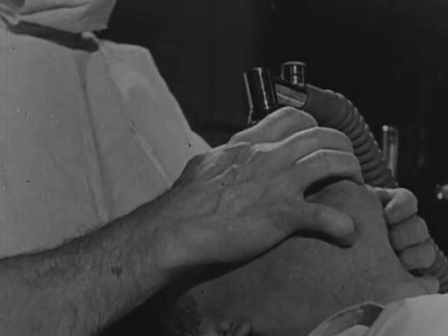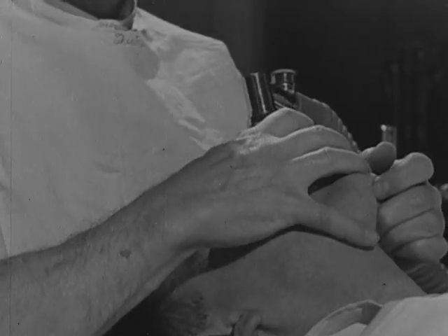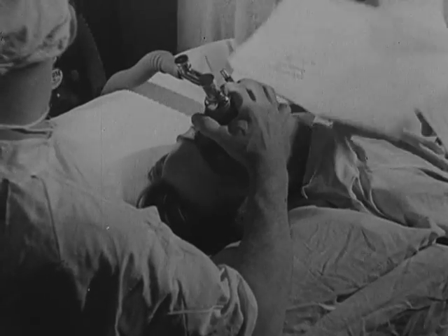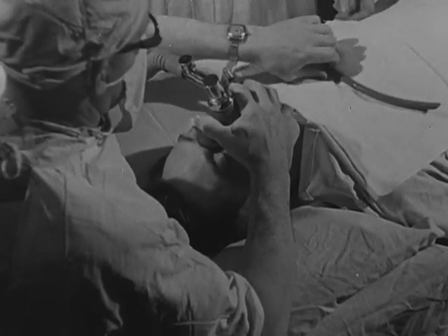First, anesthesia is induced to a depth sufficient to relax the mandible. For the beginner, it is a good idea to deepen the anesthesia even further and so make sure that the patient will still be deep enough during the passing of the tube.